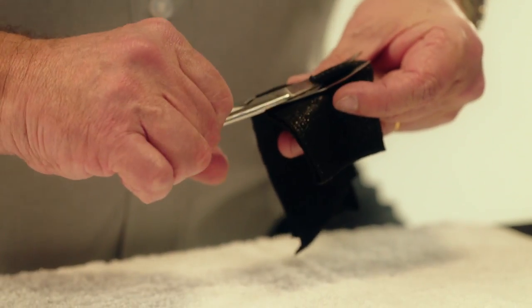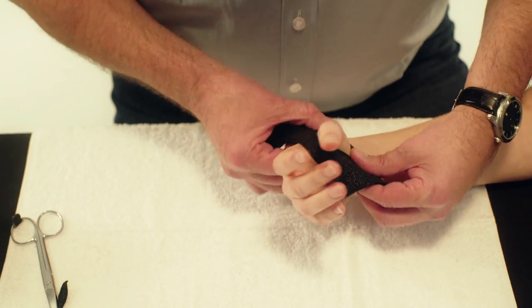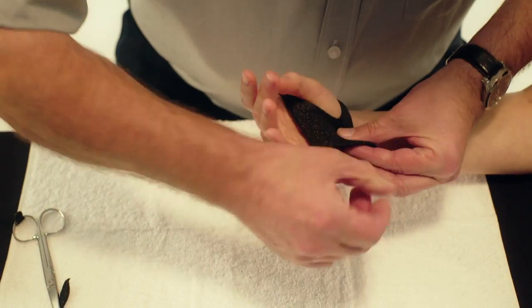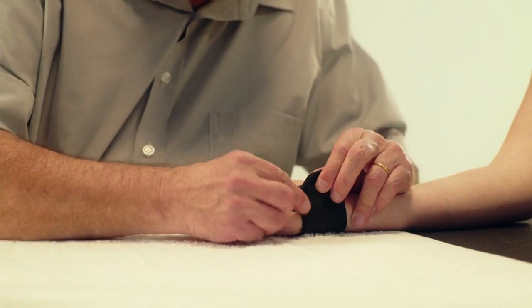Make a hole for the thumb at 2 thirds of the length and place the thumb through the hole. Pinch the OrphiCast together on the palmar side of the hand.